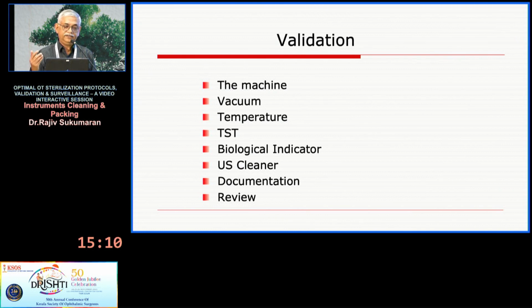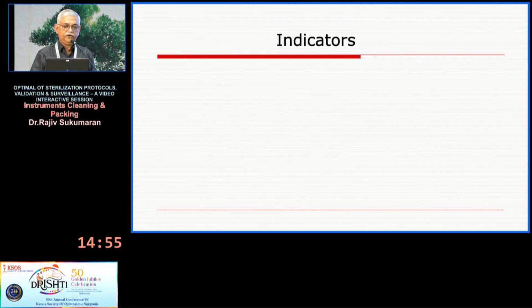And we have different indicators. The best one is the biological indicator. Then I showed you the ultrasonic cleaner and documentation. Above all, you will have to review your performance and the entire process periodically.